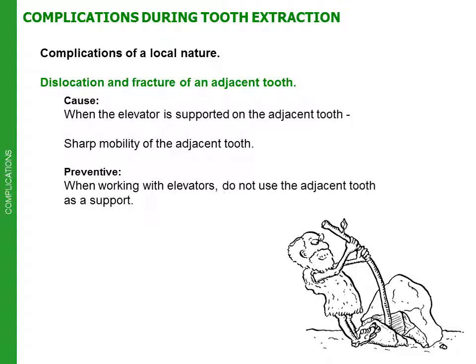Dislocation and fracture of an adjacent tooth can occur when the elevator is supported on the adjacent tooth. There will be sharp mobility of the adjacent tooth. When working with an elevator, don't use the adjacent tooth as a support.